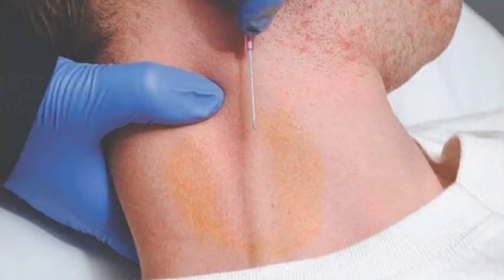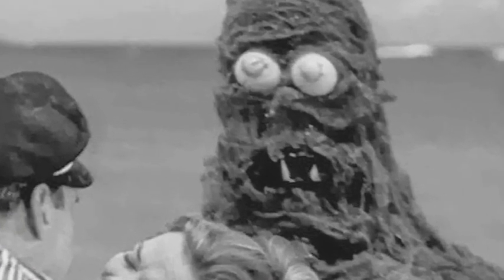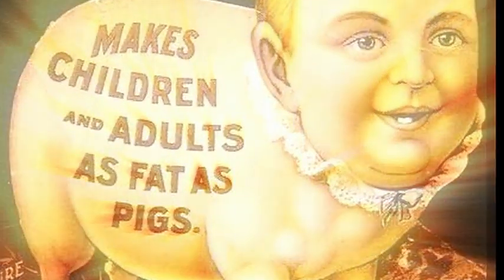Why don't any of these educational models look like the actual patients that we treat? Because it's incredibly uncomfortable to walk up to a friend and say, "Hi, would you like to be my no-necked, overweight, difficult access model for my medical education video?" Nobody is going to do that. But I promise you that the techniques I'm going to show you do work on the average ER patient who needs an EJ.